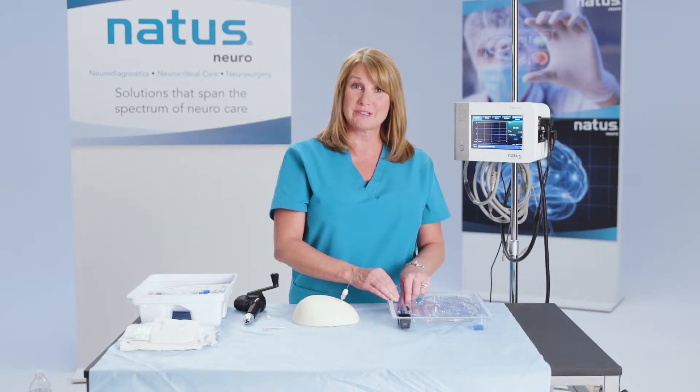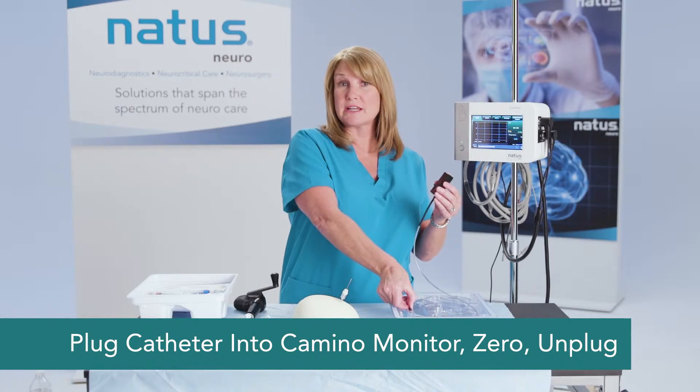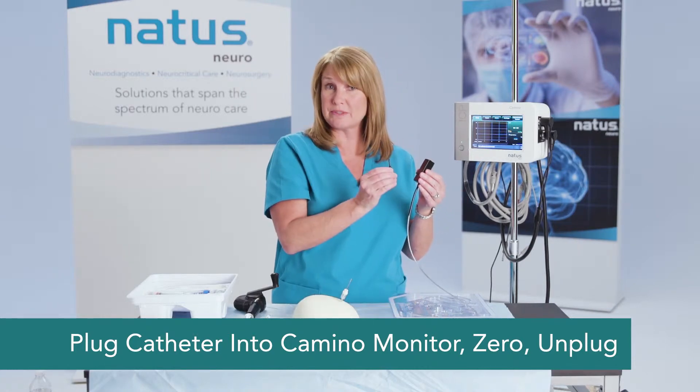Now we want to zero the catheter. You'll do that using your zeroing tool, just as you would with any of the other fiber optic catheters.